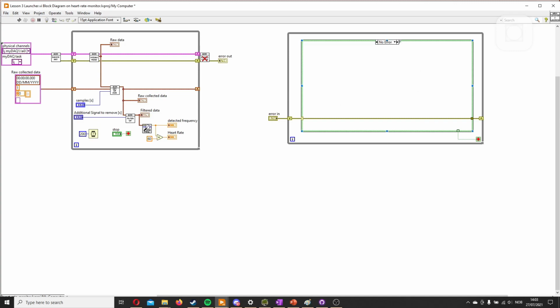You could make this part more advanced to not stop at certain errors, etc. But the point is, it's good practice when you start making an application to stop at all errors, so you can figure out how your application works and which errors you will encounter. Later, when you understand the error, you can make an exception for it. But starting by making exceptions or not stopping on errors can cause harm to some products.